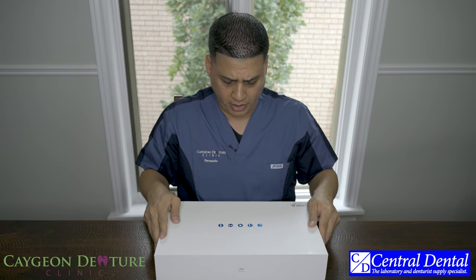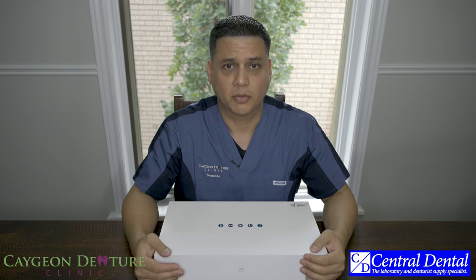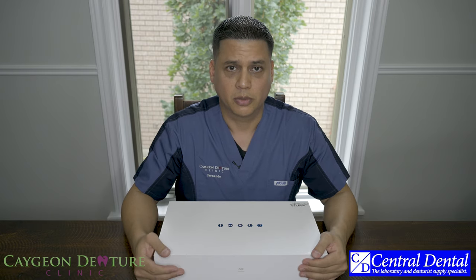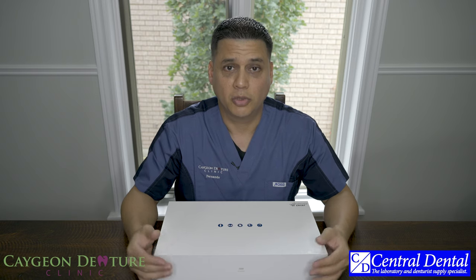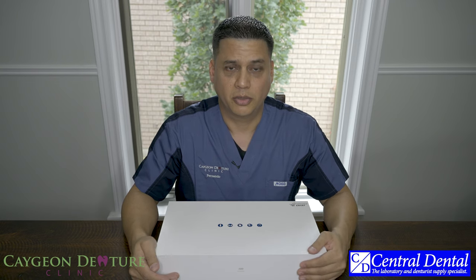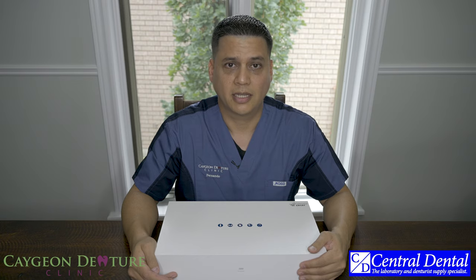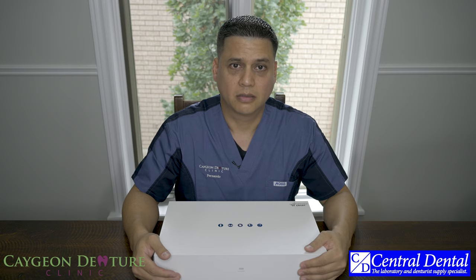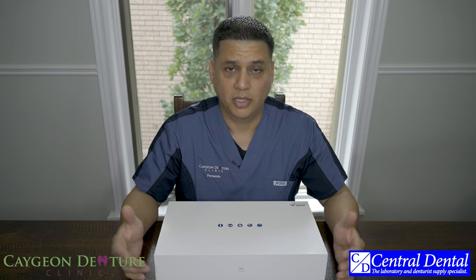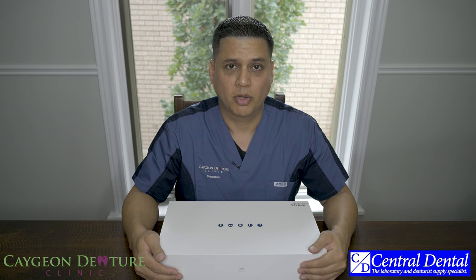Of course, you cannot do any of this scanning without a computer. Central Dental does not provide the computer for you — they allow the user to get their own. We'll talk about the computer I bought to use with the scanner. Whether you get the Medit or a different scanner, the computer should be up to par to ensure the workflow is easy and you don't have a lot of lag with the software.